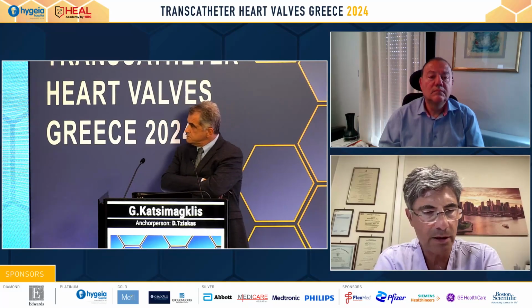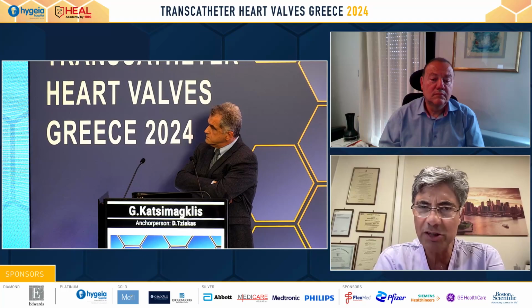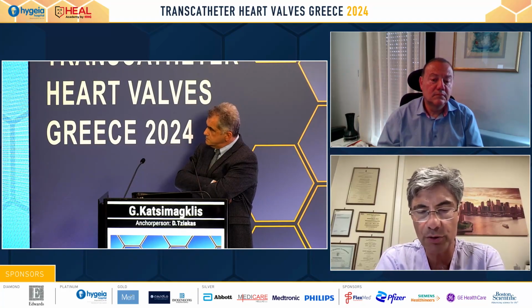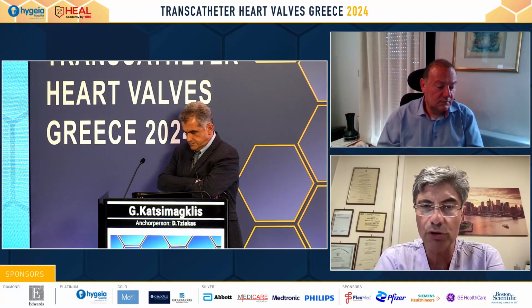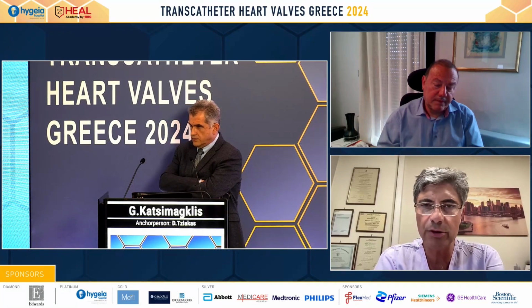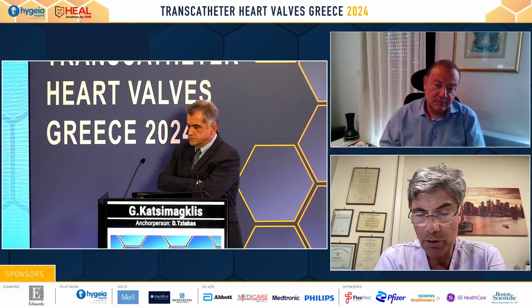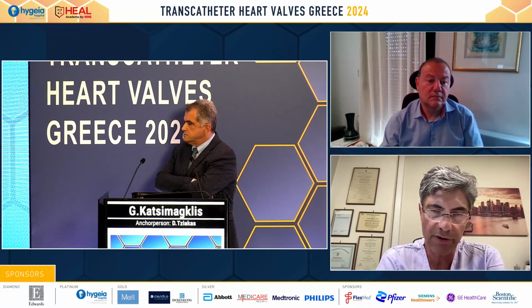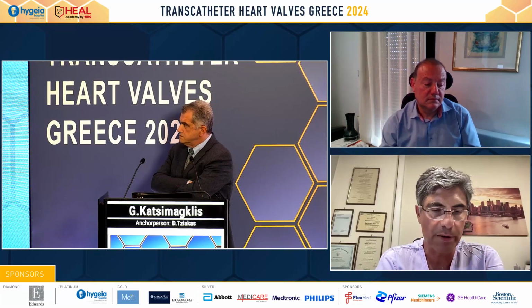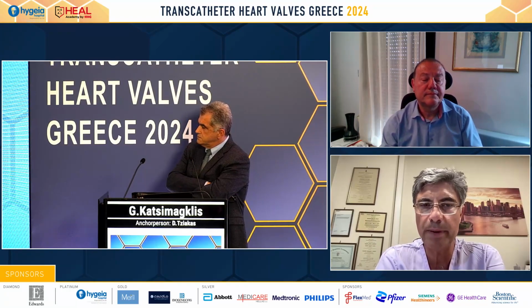And I noticed in your case, which is really interesting, when we want to stabilize the self-expanding valve, which is embolized upstream, I think it's better to try to stabilize the valve with 2 snares as opposed to 1, because otherwise you risk the danger to distort the valve and also to damage the aorta. So I think this is something that we learned in the last few years. You have one more access, and then you place a second snare. You stabilize the valve, and it's easier and also more safe for the procedure and the patient to place a second valve inside the other one. Okay. So overall, I think it's something that everyone who is doing this business should pay special attention to now. Yeah, statistics never lie, as usual.